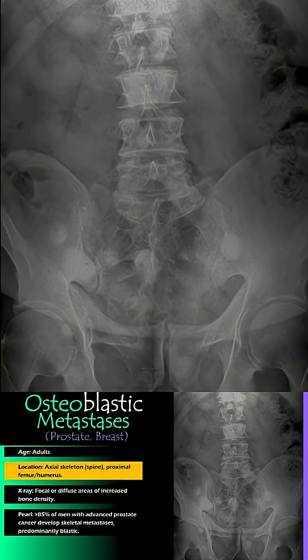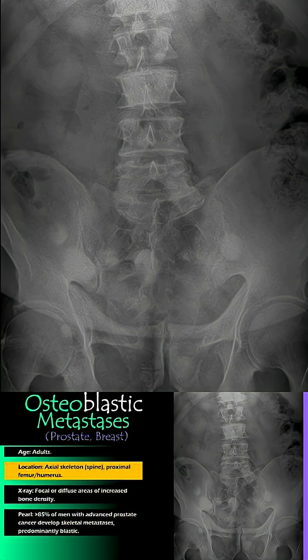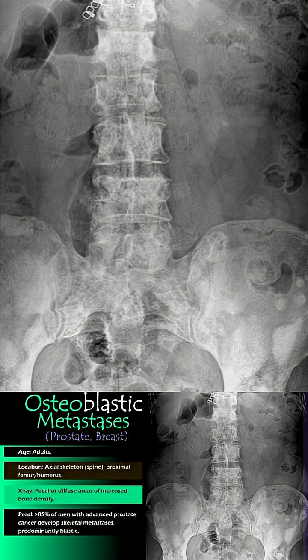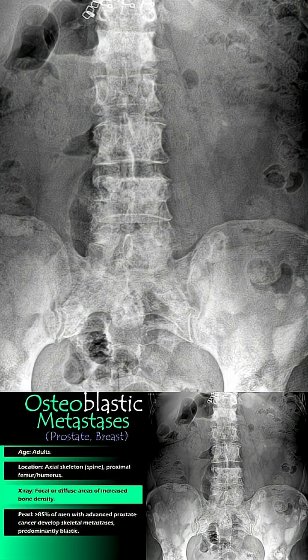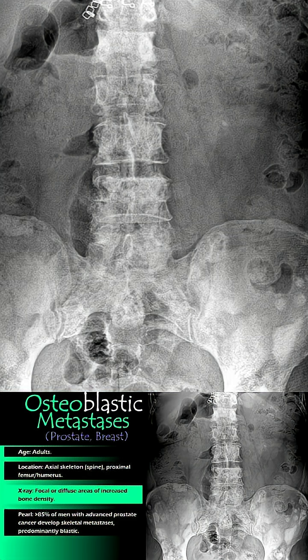These lesions typically occur in the spine, pelvis, ribs, or proximal femur or humerus. On X-ray, blastic metastasis appears as focal or patchy areas of increased density. They can be round, nodular, or even diffuse.